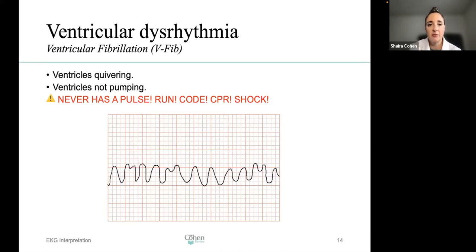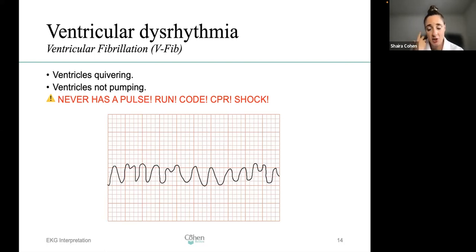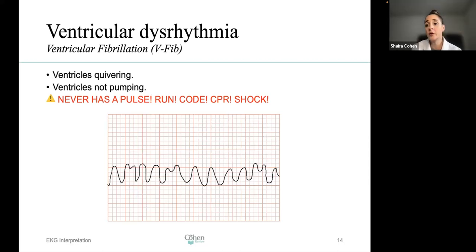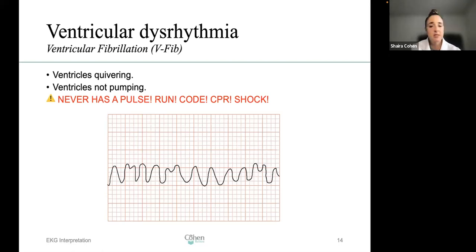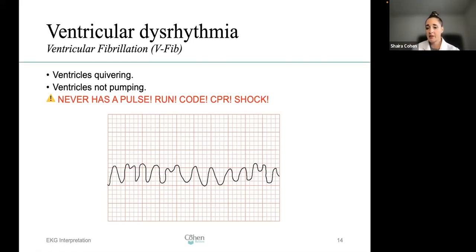Ventricular fibrillation (V-fib) — not good at all. The ventricles are quivering, which is extremely dangerous because the ventricles are in charge of pumping blood to the rest of the body. If the ventricles are not working, the body is not receiving blood. There will be no pulse — run a code: CPR, shock. Looking at the strip, it tells you nothing. There is no P, no QRS, no T wave — just a scribble. Something is happening, but there are no recognizable waveforms.